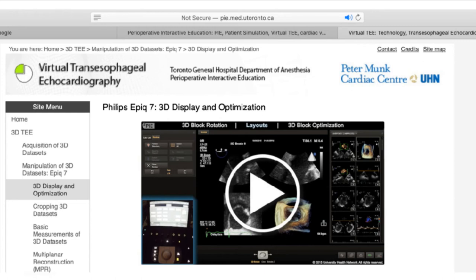Depending on the system, we can display it as two perpendicular images, or three perpendicular images - the plane of origin, the perpendicular plane, and the plane that cuts through it. Now there's also something where different vendors have different approaches: the planes are perpendicular to each other cutting in the center, and you can now actually change the angle. So finally, for 2D images there's not much we can do post-acquisition, but for 3D images there's still a lot we can do.